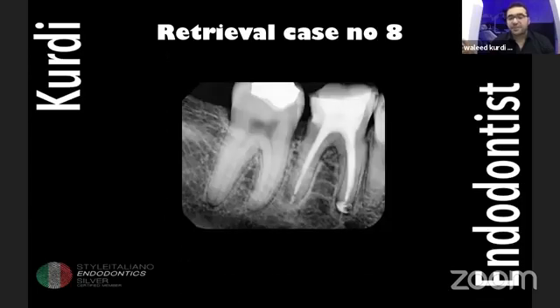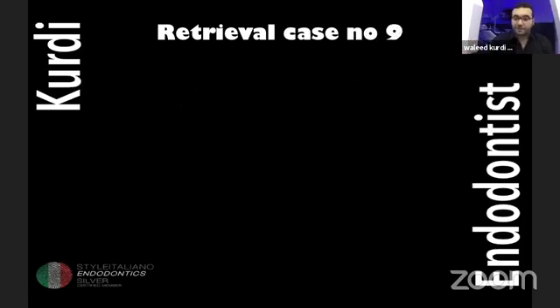Here's the post-operative X-ray. Indeed, it's not perfect as if you were doing just root canal treatment or even conservative shaping, but I was really conservative in removing this file because of the great Ultra X tips and the great BTR pen for retrieval.